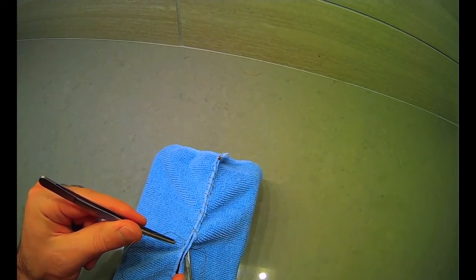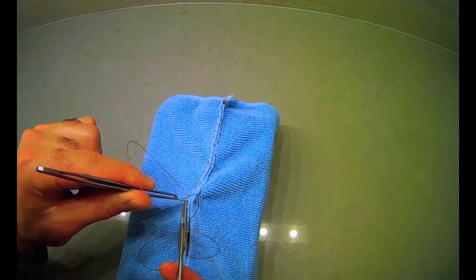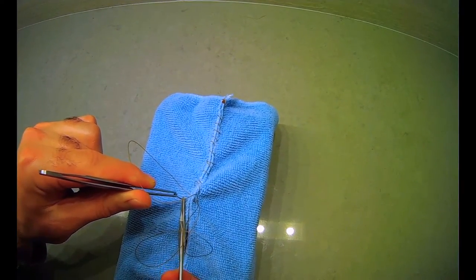And as you can see, as I'm throwing, when I drive the needle, I'm letting the sharpness of the needle do all of the work. I'm just rotating through. Before I unlock, I'm using my ADSEN forceps to hold on to the needle. Then I unlock, and as I pull it through, I can start loading the needle again in the right orientation.